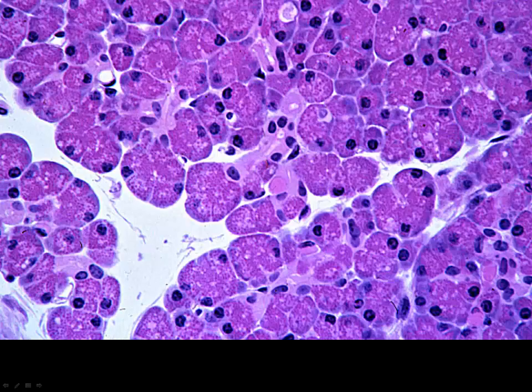Another view of the parenchyma present in the pancreas. Again, we can see the serous parenchyma. We have those centroacinar cells almost intercalating between the acinar cells, so they're quite abundant in this pancreatic tissue.